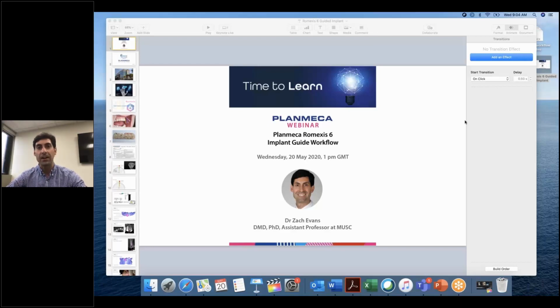So we've been using some early versions of Romexis 6 for a little over a year. I'd like to share our experience using that, but also give you guidance on things that we've done to be more successful doing guided implant surgery in my practice, and when teaching students and residents, and definitely learned a lot from there.